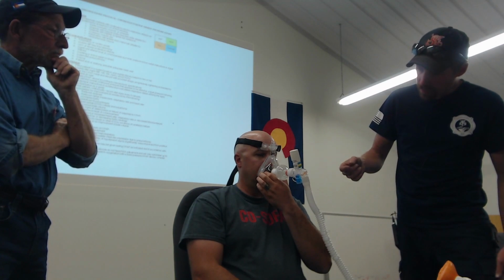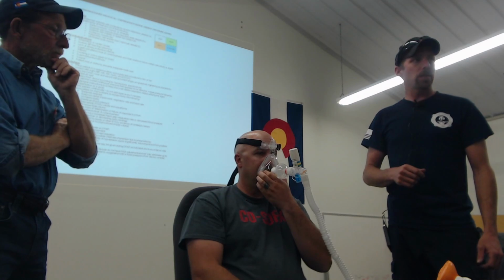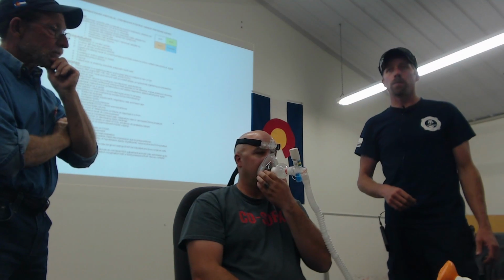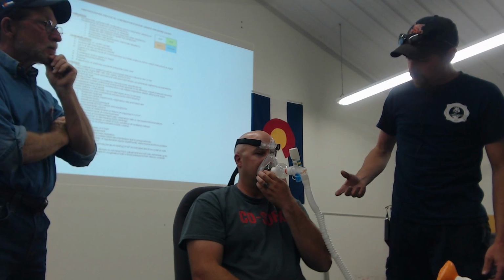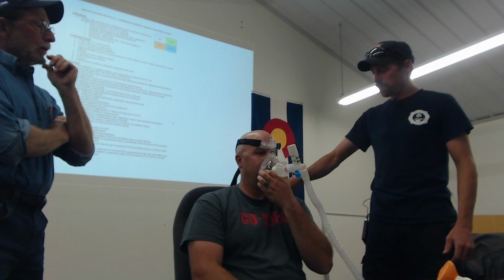So you can kind of see on Tyler's face here that medium is definitely not quite right. In a pinch, it's going to work. We're sealing. I can see it's covering up his nose. How does it feel to you? It's small, but it's sealing. So, if you had nothing else, it might do, but a bigger mask for this patient would be better.